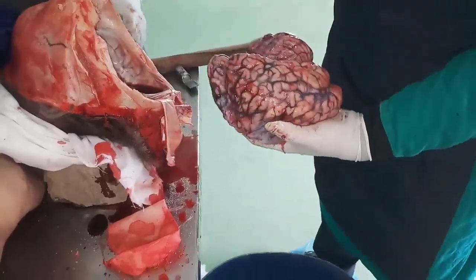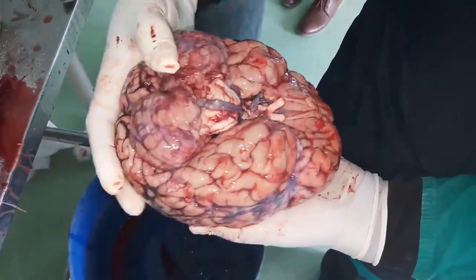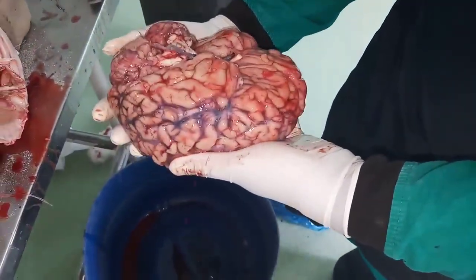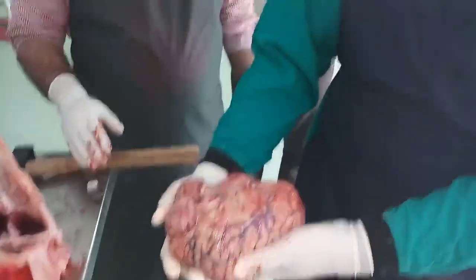So this is the brain, the complete brain, with both cerebellar hemispheres, with the pons and medulla. It is very soft. We'll put it in formalin and fix it. Then after fixation, we will study it further.